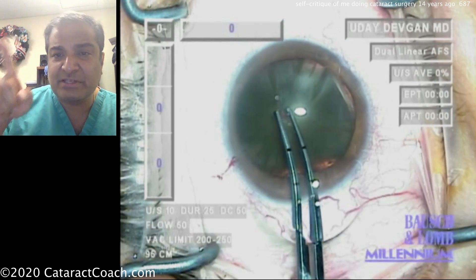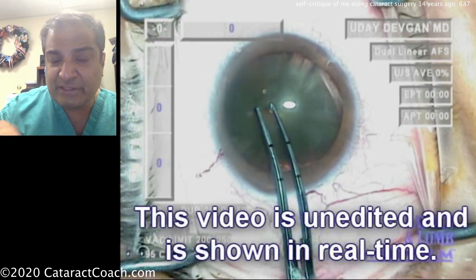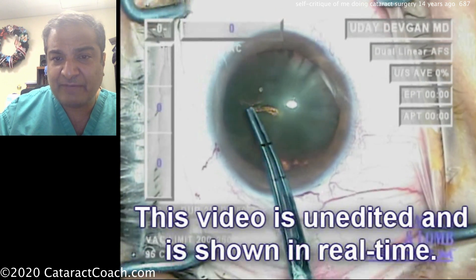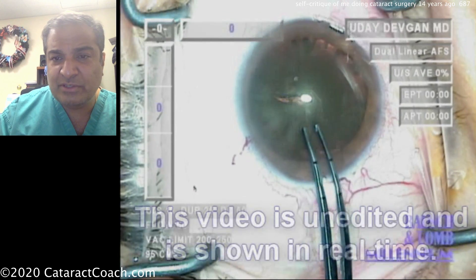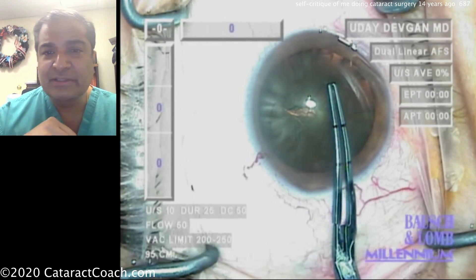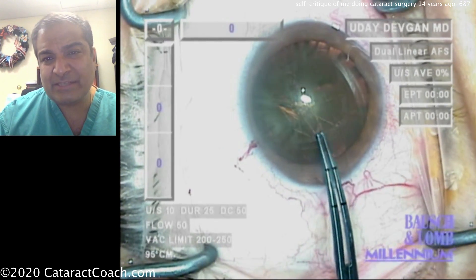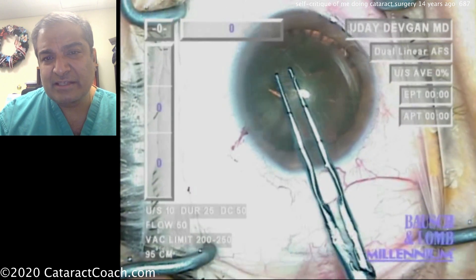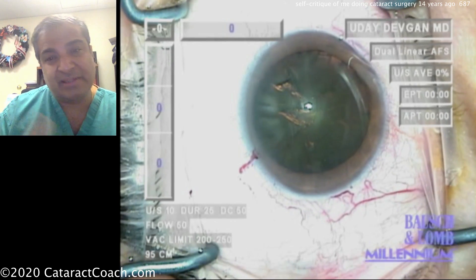Here are the forceps — let's create that rhexis. Poking in with the forcep tips, these are marked off at 2.5 and 5mm like we use now. And let's start the rhexis. Good job pivoting and floating in the incision, not hitting the sides. The rhexis looks a little bit on the big side, probably about a 6mm capsulorhexis, and I don't think I've measured it — I had the forceps but I didn't do the measurement there.